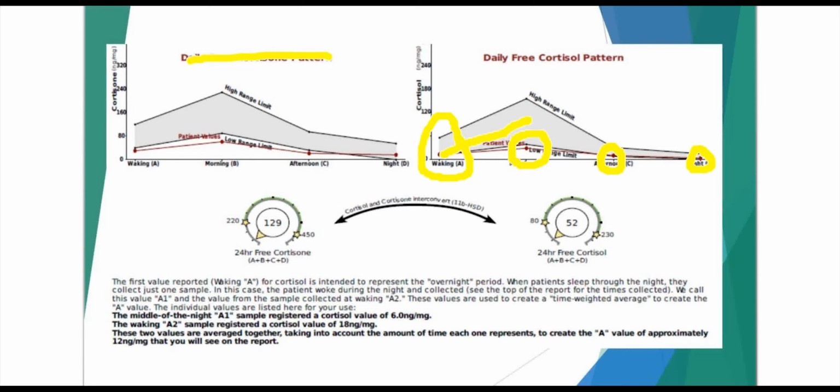Then we can also see inactive cortisone. What we generally describe is that cortisone is sort of a shadow of the free cortisol pattern. So some of the cortisol, as it enters the kidney right before becoming available in the urine, gets deactivated to cortisone there in the kidney. So this represents a fraction of the cortisol. So we're really looking at that to just confirm what the overall up and down pattern is. In this particular case, you can see it really confirms that same overall diurnal pattern.